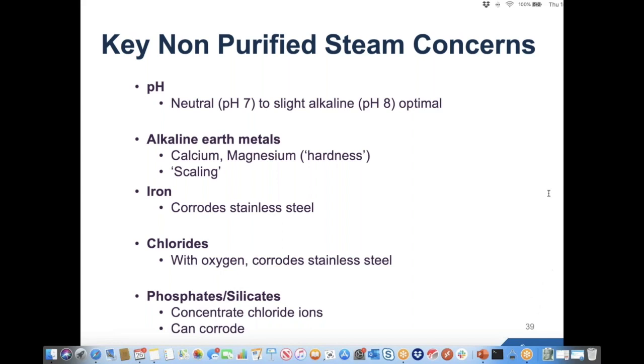The other really big one is silica that was on your list. That causes that brownish staining and really makes the instruments ugly. It's not as dangerous as the other three, but like you said, they can have RO water, but if the water feeding the washers or their ultrasonics or their sinks that they're doing manual cleaning in is poor quality, then it's certainly getting those three levels of higher pH and higher conductivity and higher chloride content that's eating that passive layer of the instrument. So really important that folks truly understand the impact that water and steam have on their instrumentation.